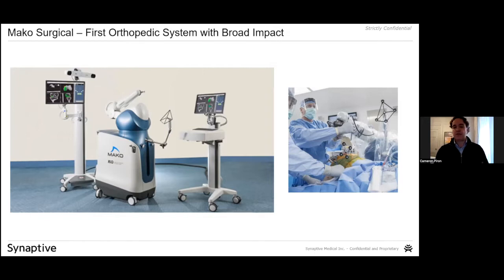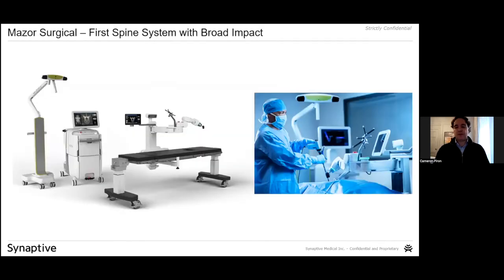And it's the idea of using X-ray imaging to guide the bone drilling and be able to take that very complicated process and simplify it much better. This was also done in spine. So here you see a bunch of the technologies, very similar looking robotic arm. You're seeing cameras here, infrared cameras to track the drill and the guide and the devices.